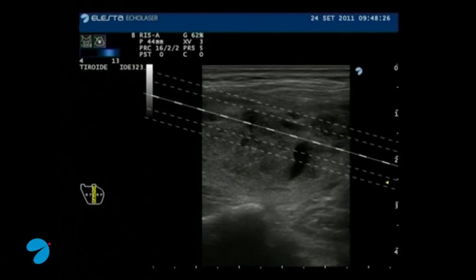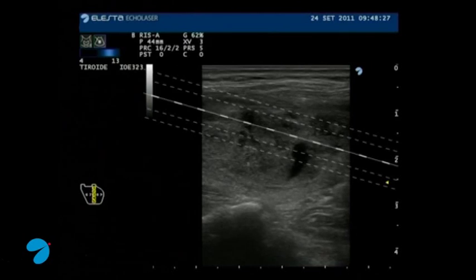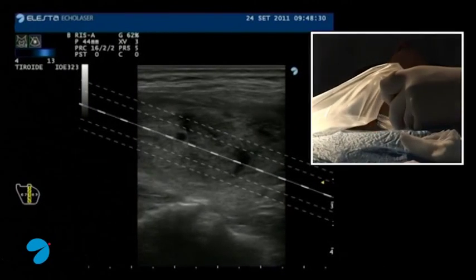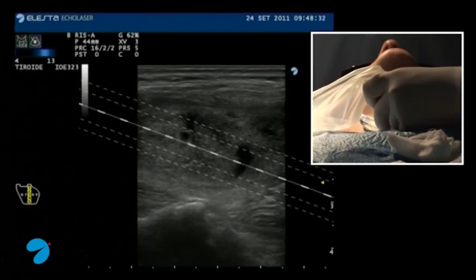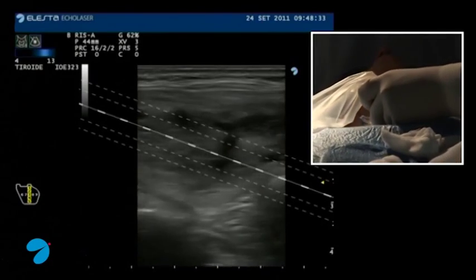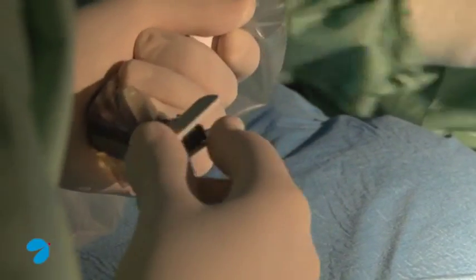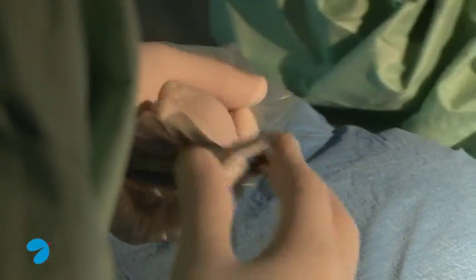We proceed to select the correct guide system in relation to nodule dimension, position, and neck morphology. We choose the most appropriate needle guide system, which we mount on the probe.